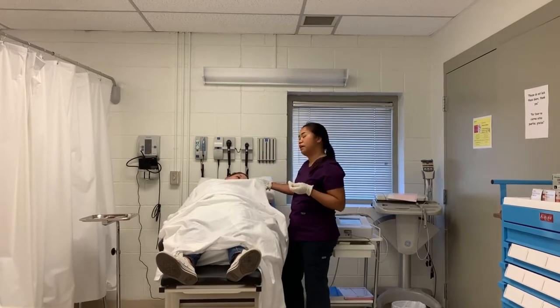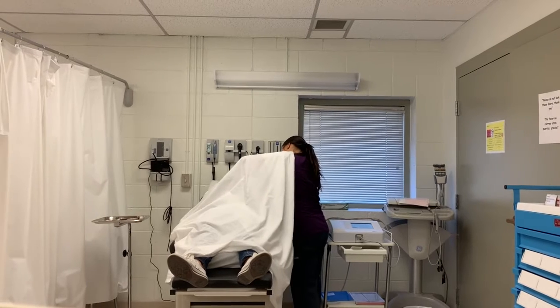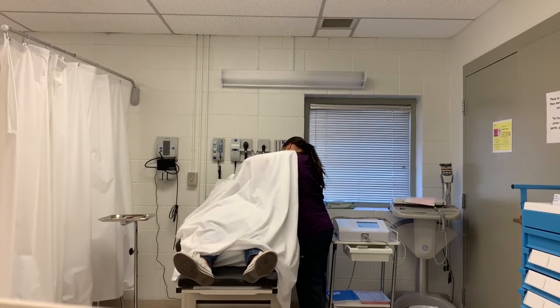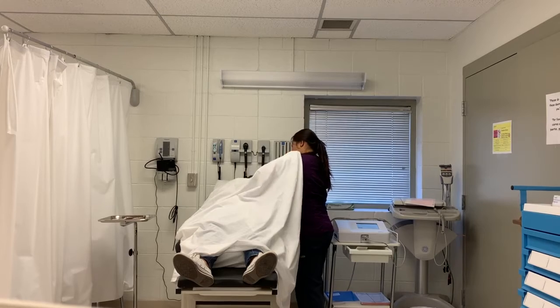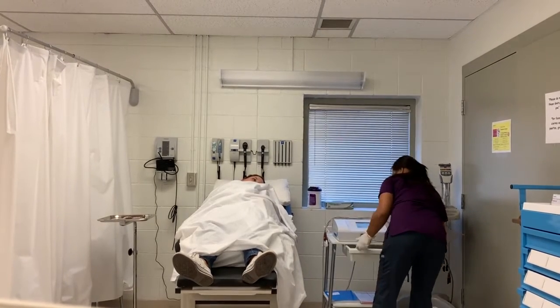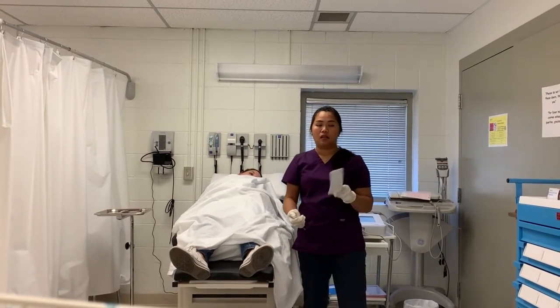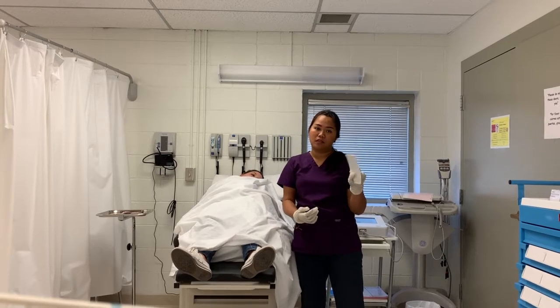I want to make sure my patient is covered at all times. So now that I've cleaned all the skin where I will put the electrodes, I'm going to go ahead and stick the electrodes on her.